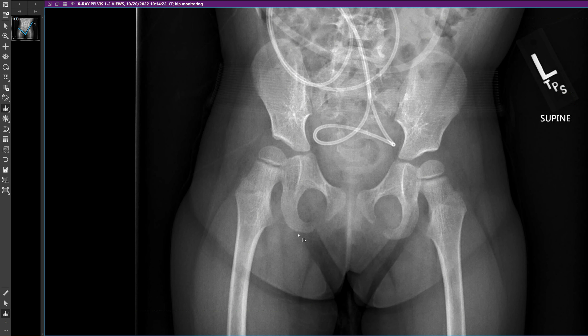What I do is choose a landmark that is relatively symmetric. You can choose the bottom of the ischial tuberosities, top of the iliac crests, or the teardrop distance. For the sake of simplicity, I'm just going to choose the bottom of the ischial tuberosities.